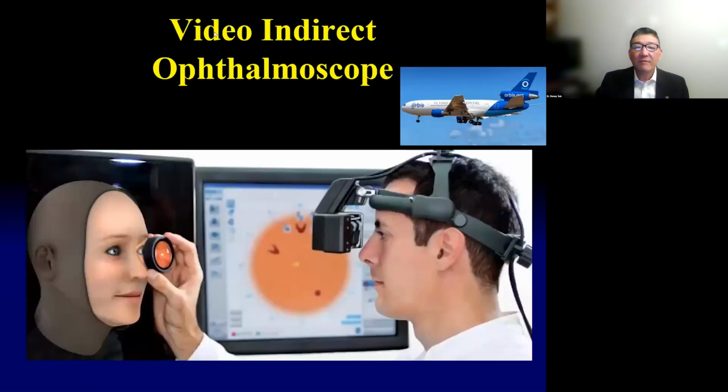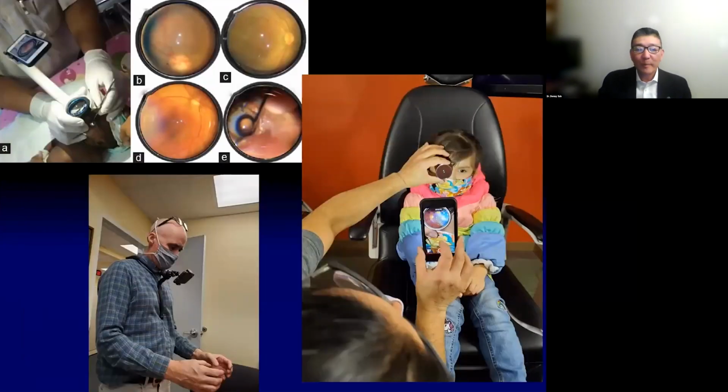And then after that, of course, we have the video indirect ophthalmoscope, which we use in the Orbis airplane to train our trainees. And this is very nice because the observers can watch what the examiner is looking at while the examiner is looking at the fundus, and we can help and guide and teach. So it is a great teaching tool.